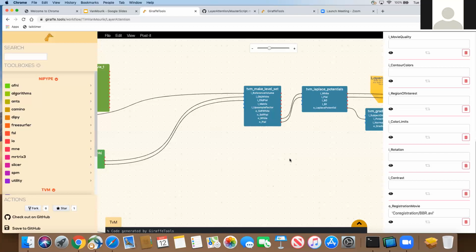Yeah, just a second. I think we're not yet at the stage of doing these high resolution scans, but hopefully, for this neuroscience application, get subjects. I think with a 10-minute long FLASH scan, you've got a pretty good shot at getting it.